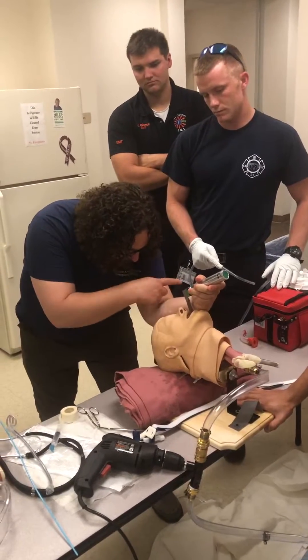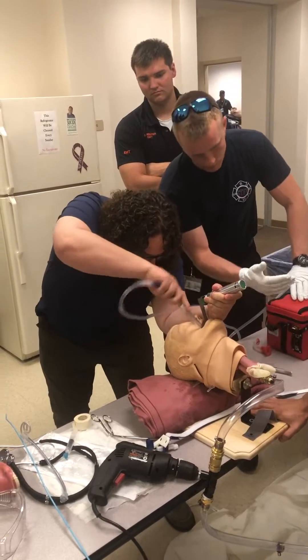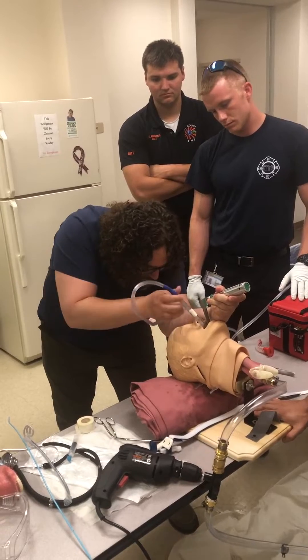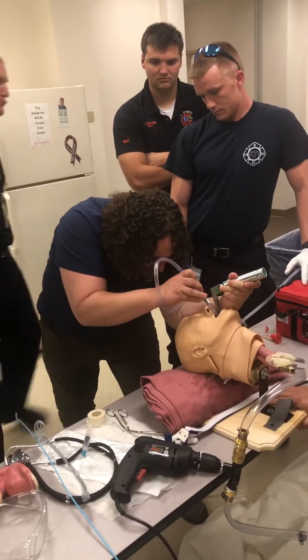The airway keeps filling up. I need suction. Suction is on. I have it in here, but every time I take this out I can't even keep it in because it's coming through the cords. So I'm going to instead pass this through the trachea.